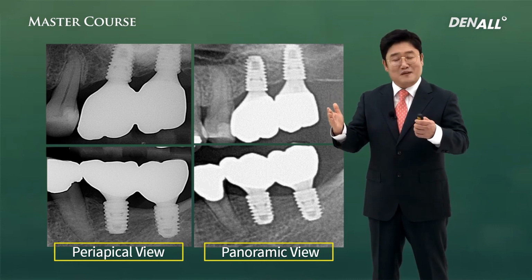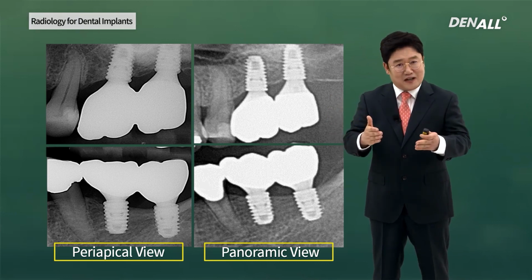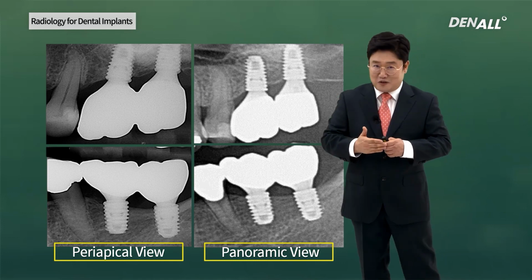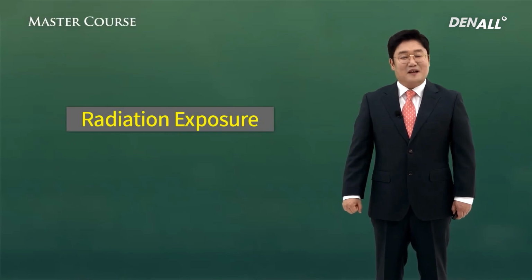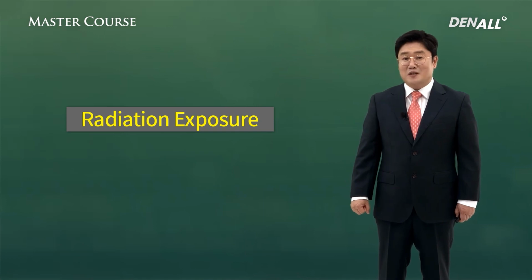Compared to cone beam CT, the information is limited. The coverage of the image is restricted. That's something we have to acknowledge. We have looked at CBCT, panorama, and standard periapical radiology.